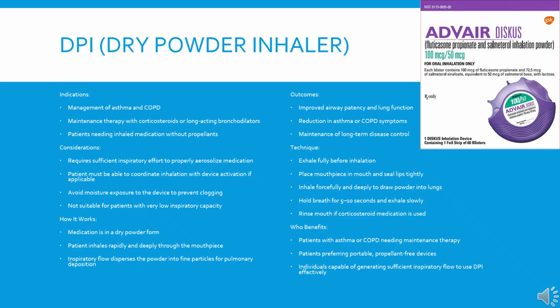The technique: exhale fully before inhalation, place mouthpiece in mouth and seal lips tightly. Inhale forcefully and deeply to draw powder into lungs. Hold breath for 5 to 10 seconds and exhale slowly. Rinse mouth if corticosteroid medication is used. Patients, again, with asthma and COPD benefit greatly.